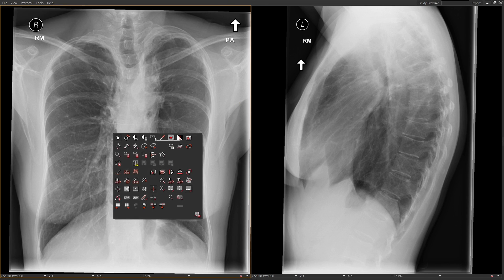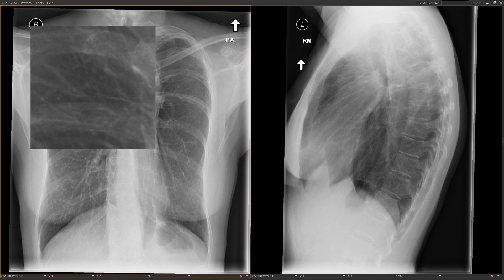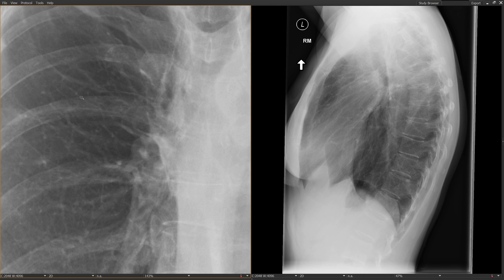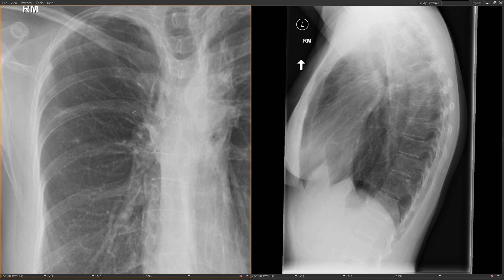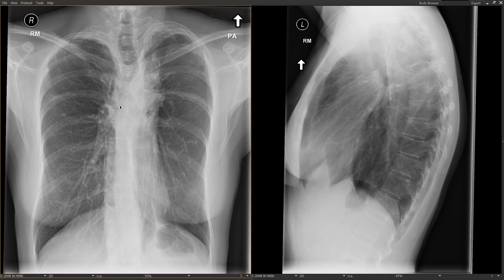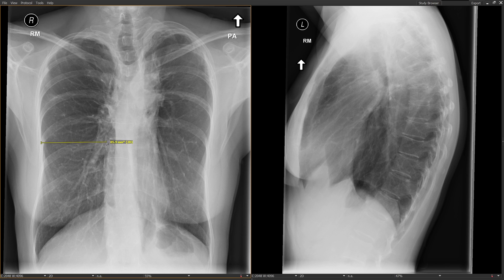The third finding in this patient is that the minor fissure is displaced upward — it's too high and it's also slanted, when it should be horizontal. The minor fissure is also called the horizontal fissure because it goes from right to left. So that's another sign that we have upper lung predominant fibrosis in this patient.